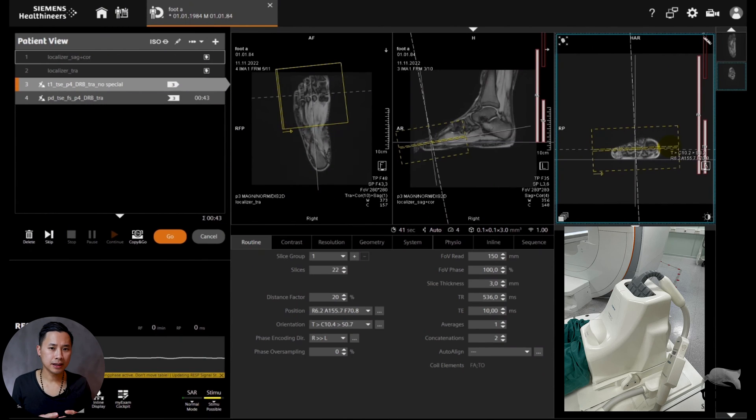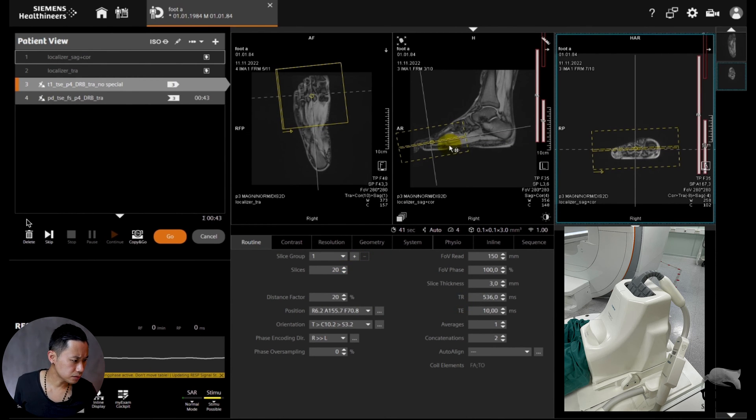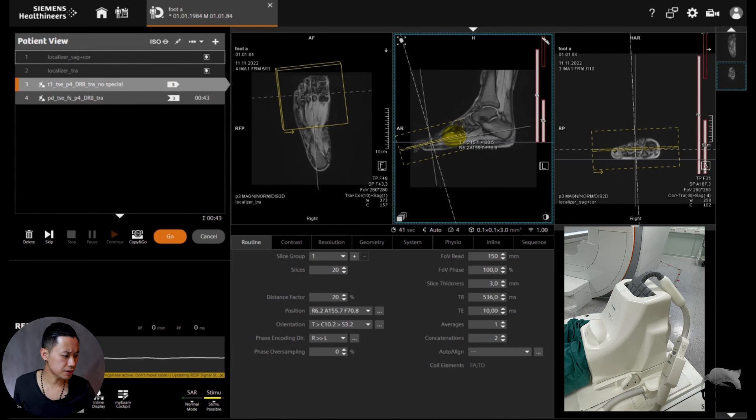Here I'm combining the foot-ankle coil and the special purpose coil on top of the forefoot. This is very good because it helps to fixate the foot and makes it easier for the patient to stay still, especially on the forefoot. We're going to do four sequences today — T1 and PD, with and without the special purpose coil. So here, with no special purpose coil on, we're just going to try to do this one sequence first.